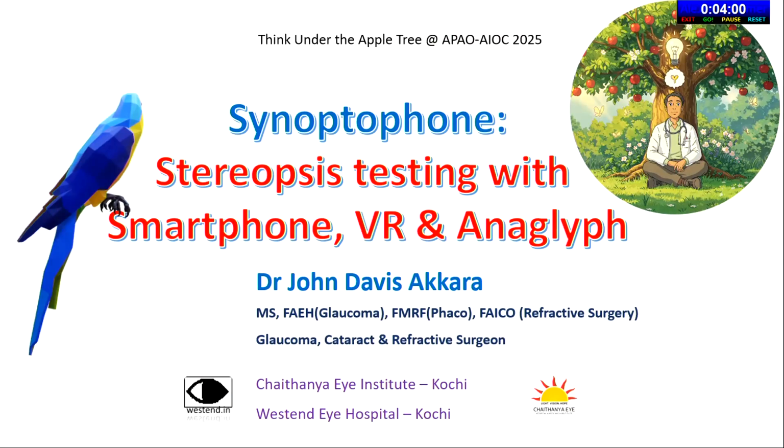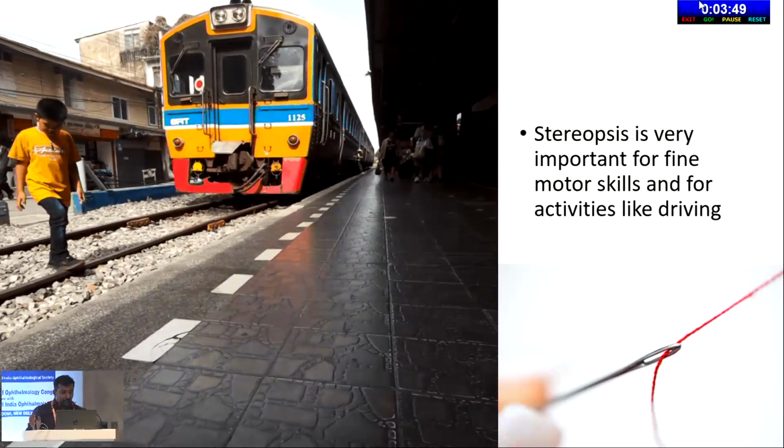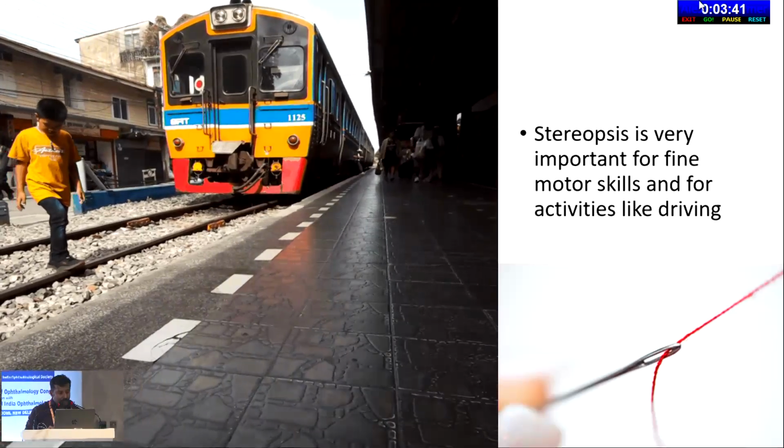This is Synoptophone, stereopsis testing with a smartphone, virtual reality, and anaglyph. So we know what a 3D photo is, and these are called wigglegrams. These are 3D photographs which wiggle between the left and right image. And we know that stereopsis is very important for motor skills and driving and so many other things.